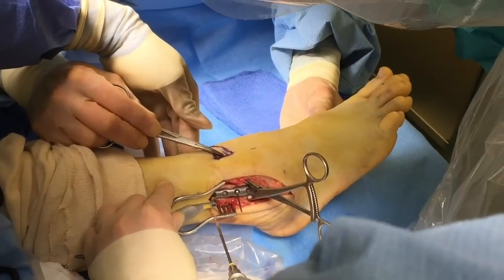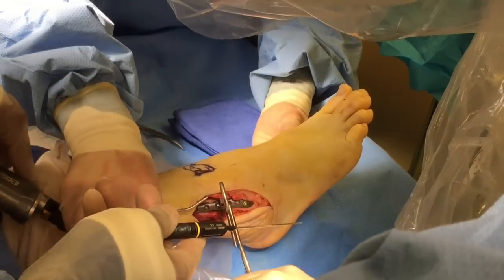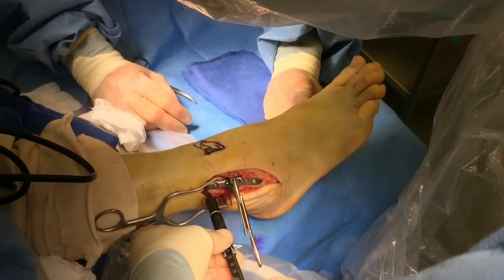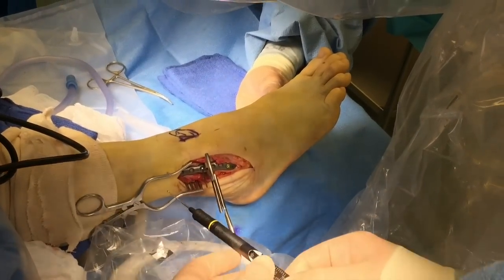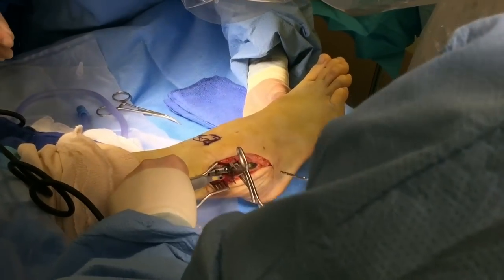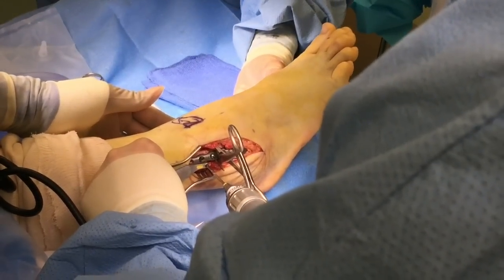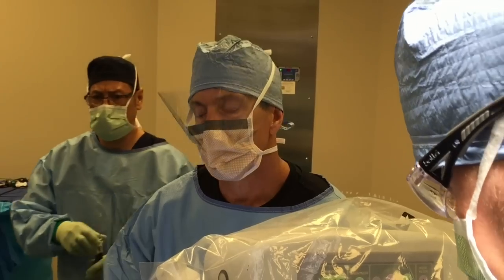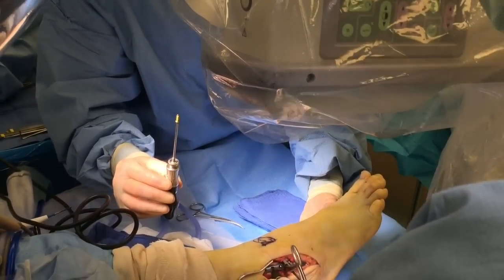There we go — and then of course measure. He measured a 12 non-locking screw in his set. Since they're self-tapping, the screws actually go right through the cortex and there's no tapping — we missed that step just now. So here's the 12 in the first hole he drilled. Looks like the second one's a 14.